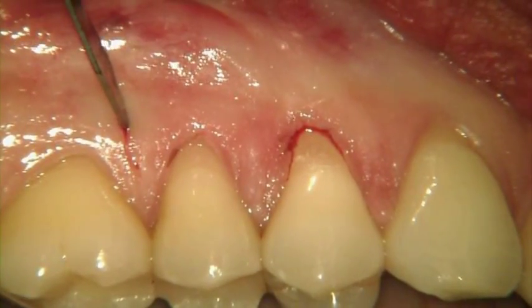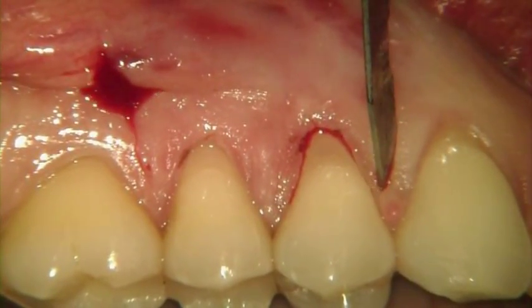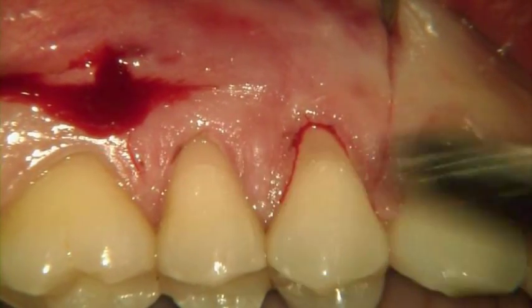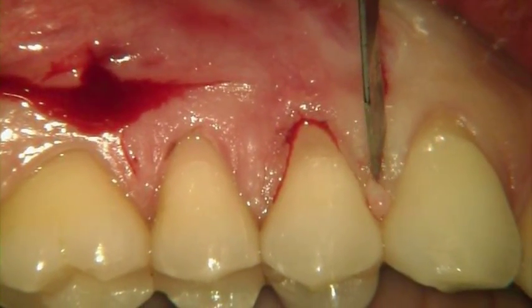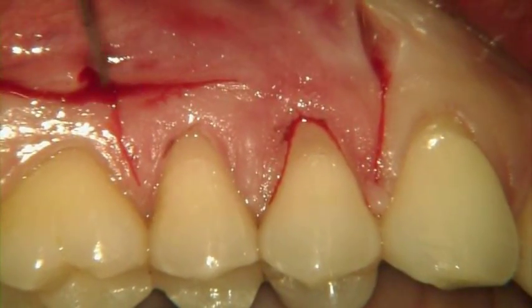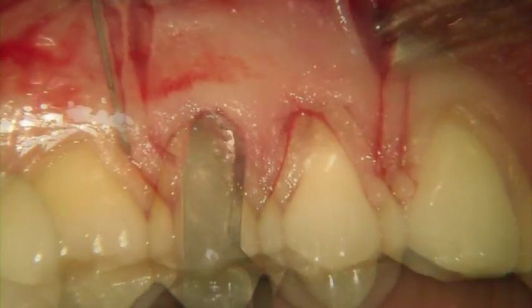Following root preparation, attention is focused on developing a partial thickness mucoperiosteal flap with 2 divergent vertical releasing incisions. Here, using a 15C blade, the surgeon begins in the distal papillary region, avoiding the free gingival margin on the adjacent tooth, but staying as close to the adjacent tooth as possible. The incision moves apically into the vestibular mucosa. An identical partial thickness incision is made on the mesial aspect of the maxillary right first premolar.